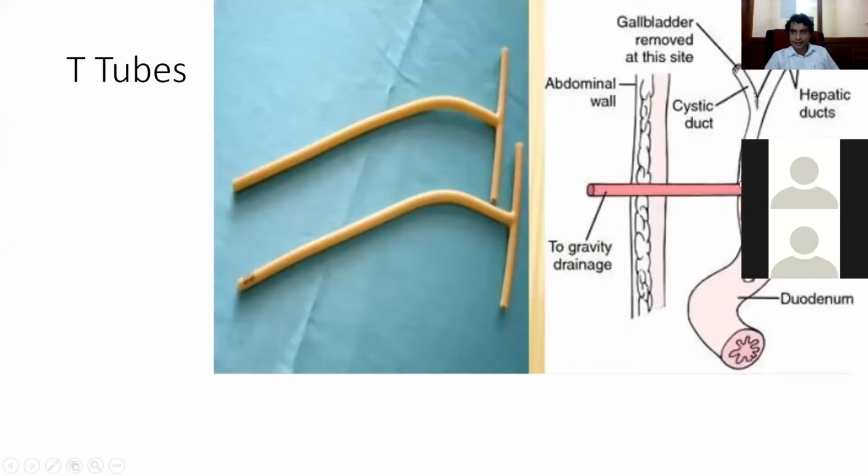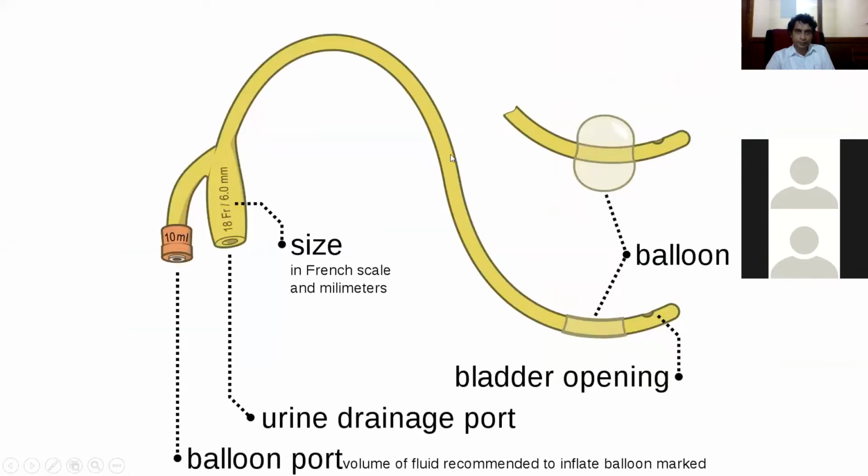Right. So your first issue is when you pull the tube, there will be a hole here. There's a space here, and there will be bile spilling into the peritoneal cavity. The second question is, how will it come out with this shape, right? So to answer your second question first, this is a very flexible tube. So the two ends will just bend and it will come out. Okay. Sometimes, I didn't want to mention it, we also cut this tube even further to make sure it comes out easily. Now this is a complete tube, no?